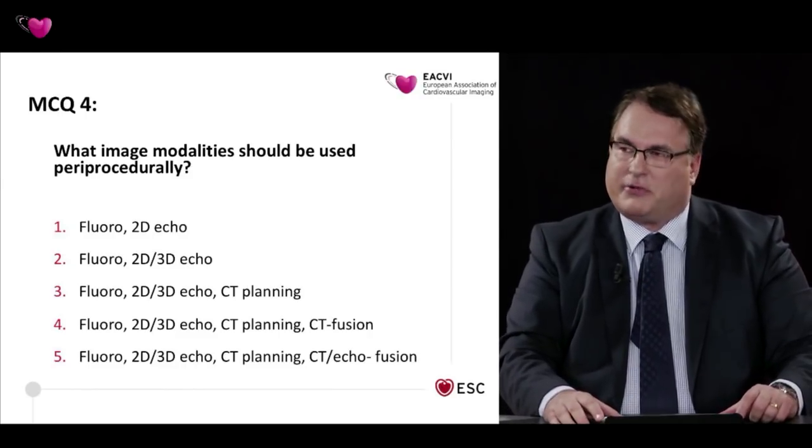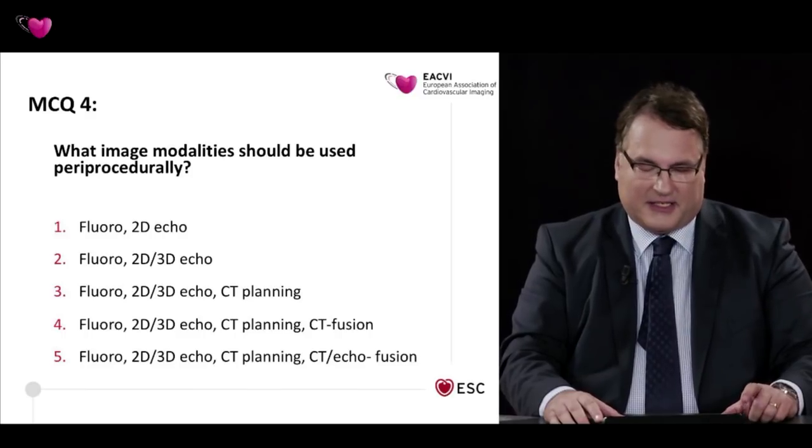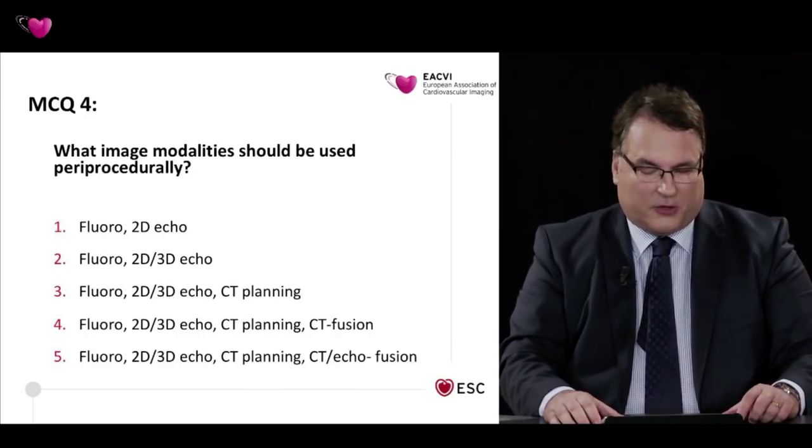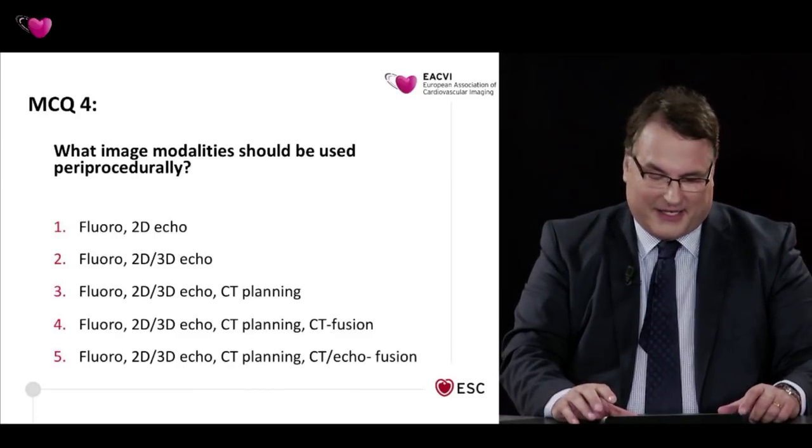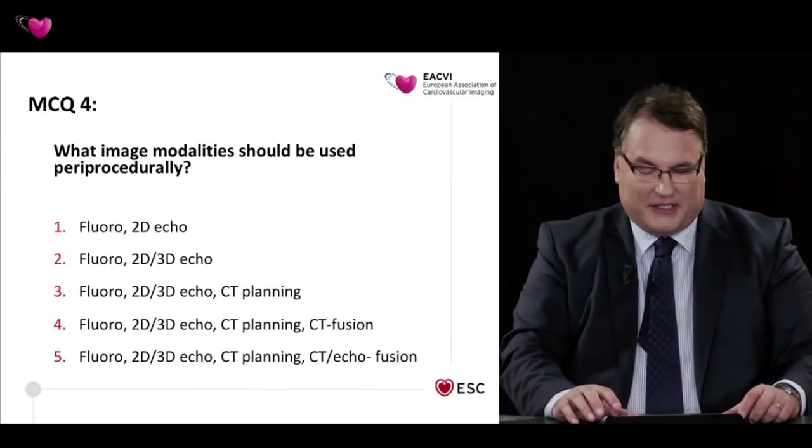I think, of course, the prevalence of the different techniques matters, and we also got, in the meantime, another question from the audience: how and when to train at all for these new modalities and these evaluations.